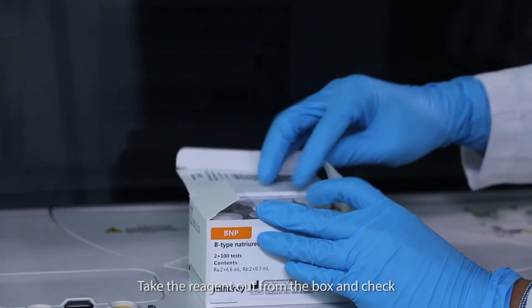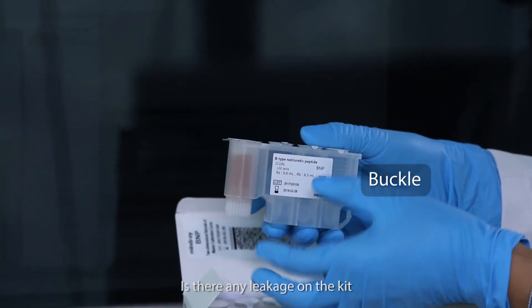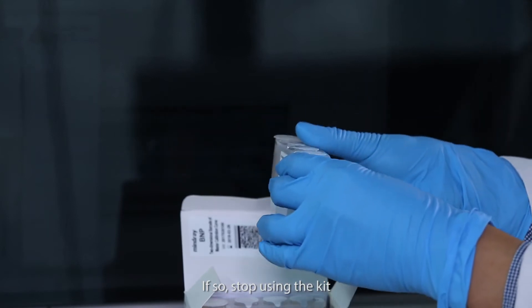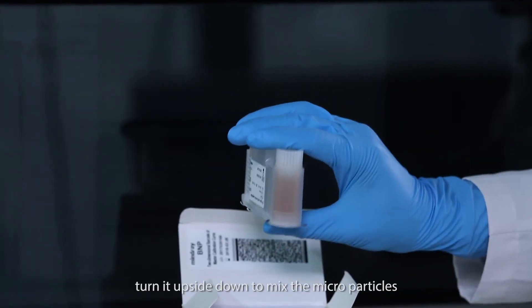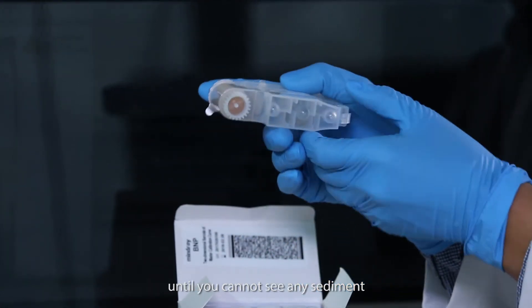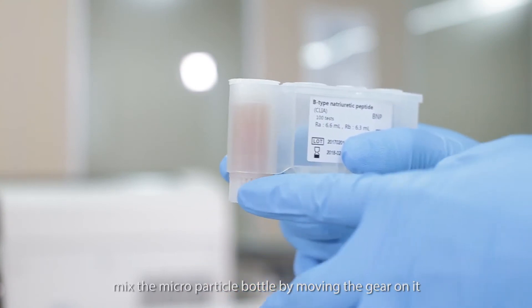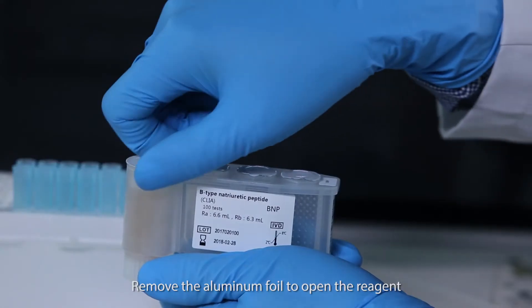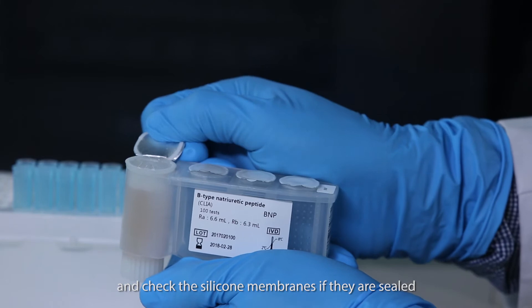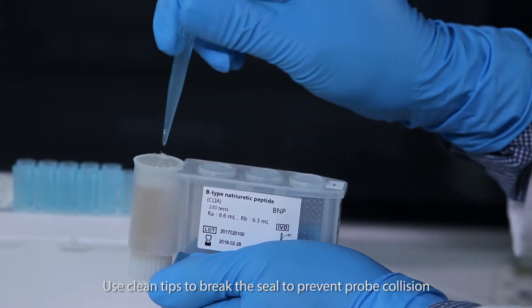Take the reagent out from the box and check. For example, is the kit buckle broken? Is there any leakage on the kit? If so, stop using the kit. If the kit is not open yet, turn it upside down to mix the microparticles until you cannot see any sediment. If the kit is already open, mix the microparticle bottle by moving the gear on it. Remove the aluminum foil to open the reagent and check the silicone membranes if they are sealed. Use clean tips to break the seal to prevent probe collision.